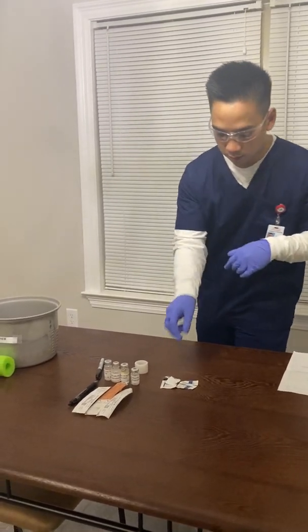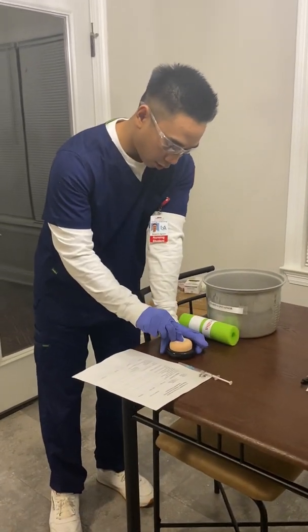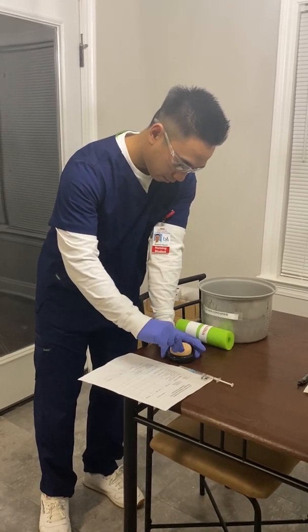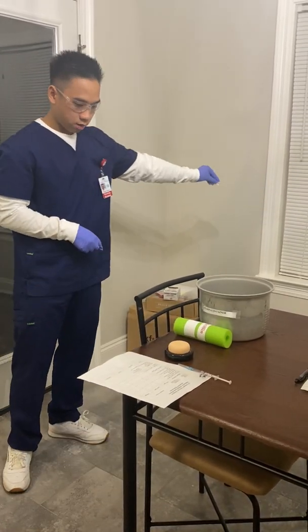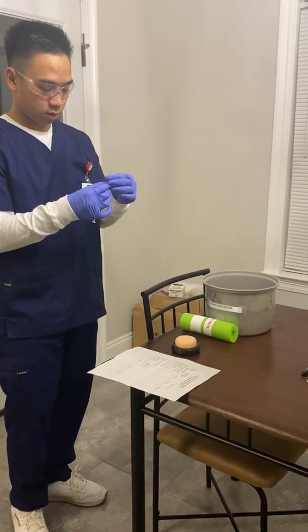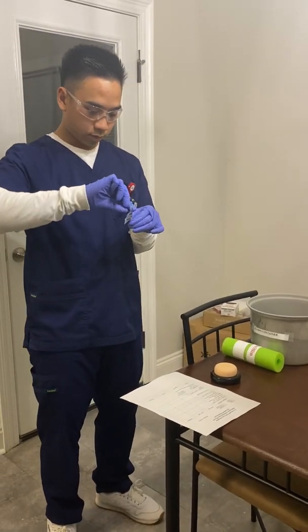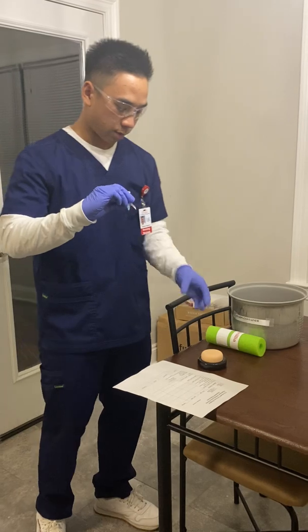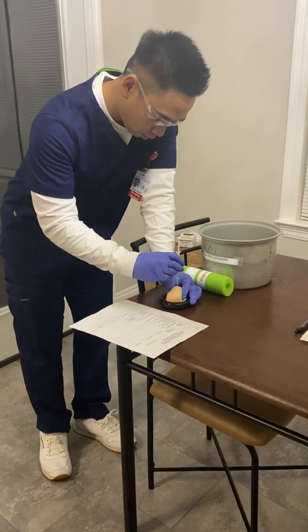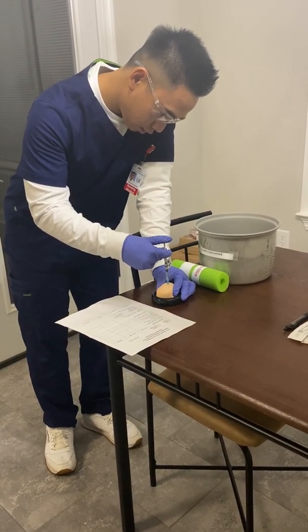So after you do that, you're going to clean the injection site. You're going to go in a circular motion. You're going to start in the middle, go outwards. All right. Now I'm going to administer my heparin. All right, so this is a subcutaneous shot, so you're going to pinch the skin. You're going to go in at a 90-degree angle. And then you're going to administer the shot slowly.